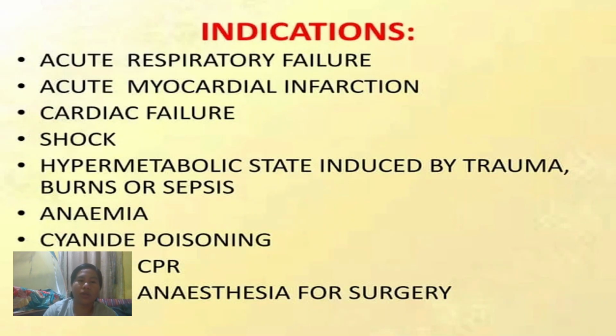Indications: acute respiratory failure, acute myocardial infarction, cardiac failure, shock, hypermetabolic state induced by trauma, burns, or sepsis, anemia, cyanide poisoning, during CPR, during anesthesia for surgery.